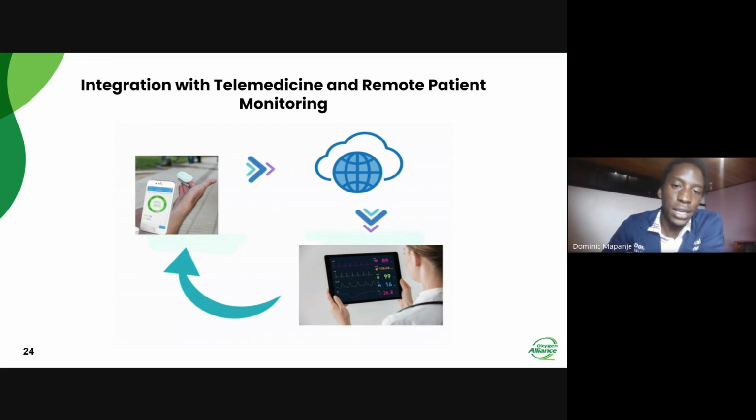As we can see in the picture, with this modern technology the pulse oximeter is integrated with your phone, so you can view the measurements through an app on your phone. These measurements can be sent to your doctor. You can see the results being sent over the internet, and your doctor is able to view them. Therefore, your doctor can provide feedback or guide you on what you should do next, depending on your current condition or health status.